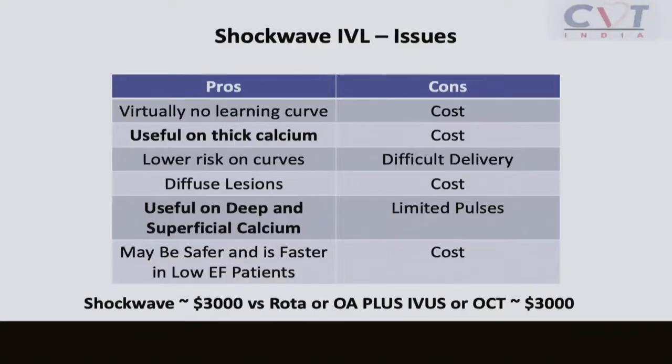And so these are the issues in the Indian, Canadian, non-US environments with IVL. There's virtually no learning curve, but it's expensive. It's very useful on thick calcium, but you bet the farm on it.